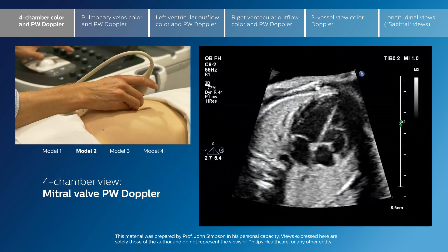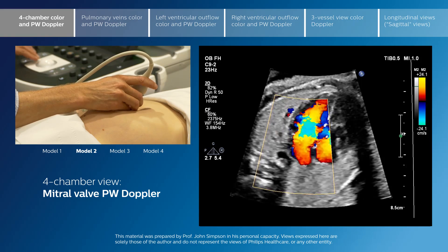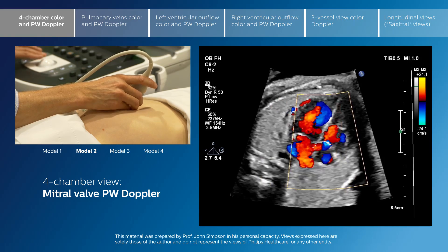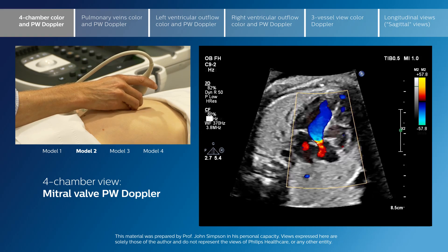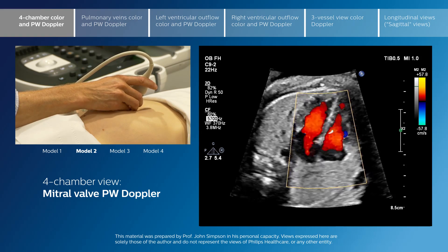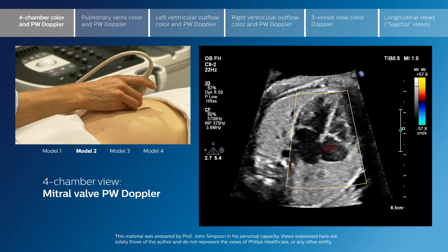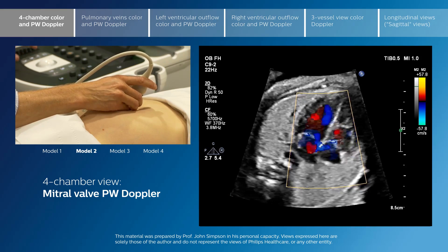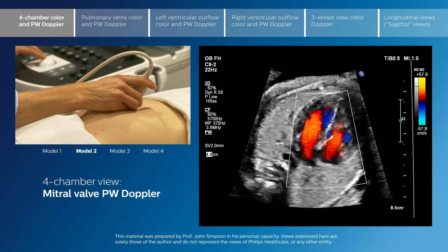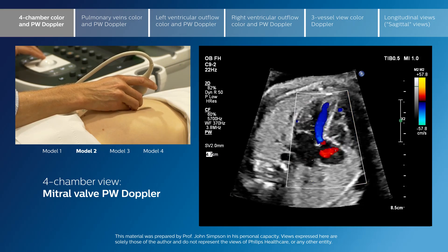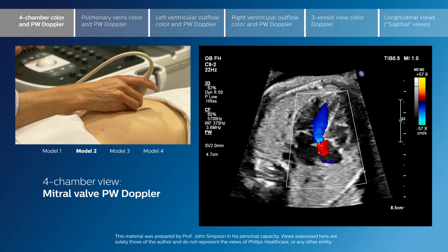We will now apply the standard colour and increase the colour scale. The colour scale should be adjusted depending on whether we're looking at pulmonary veins or AV valve inflow. Here the colour scale is around 60, which is appropriate for what we're interrogating — mitral valve inflow. I've placed the cursor just below the mitral valve.